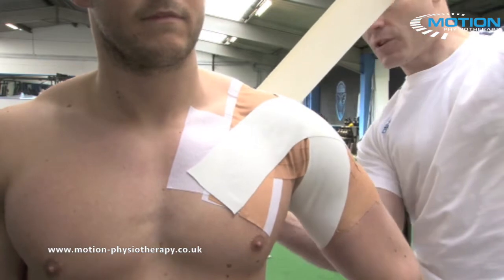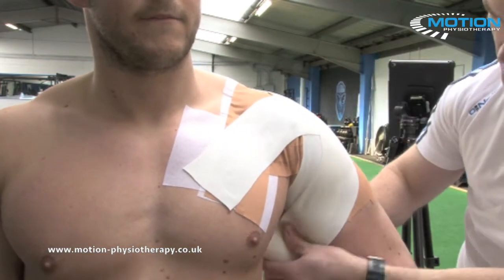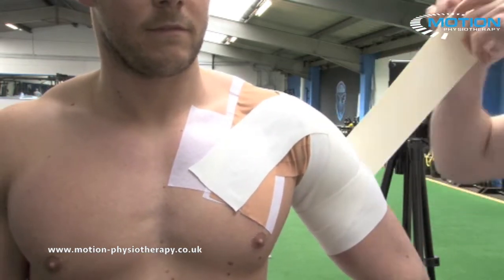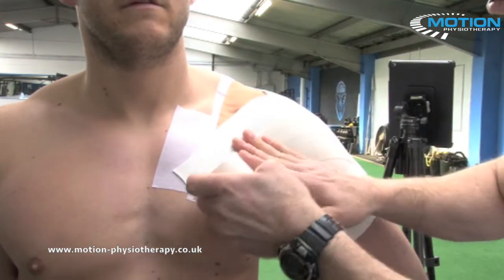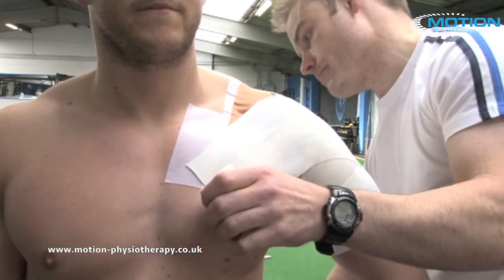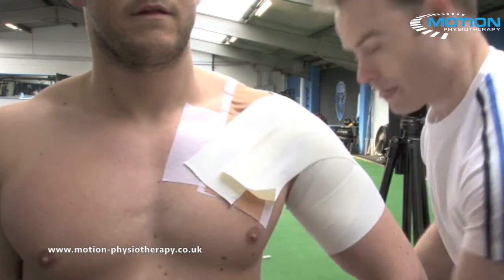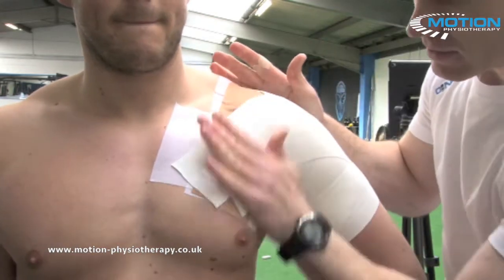Layer two half-overlaps the first one and comes down. Ask your patient to contract the bicep, then loop around the bicep. Half-overlapping what you did on the first lap, track over the front of the shoulder joint, again applying 10% stretch. Allow the end of the tape to have no stretch and smooth it down.